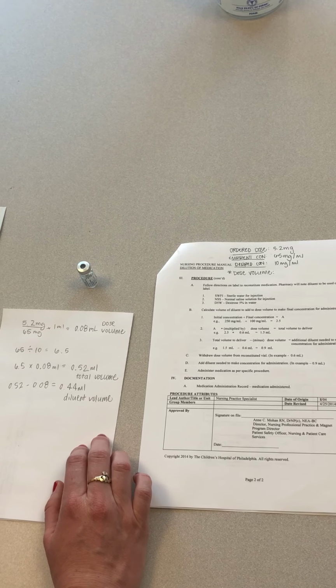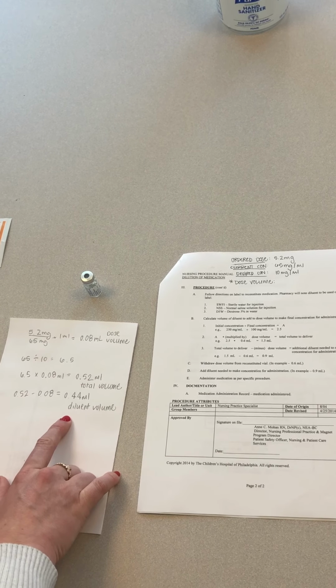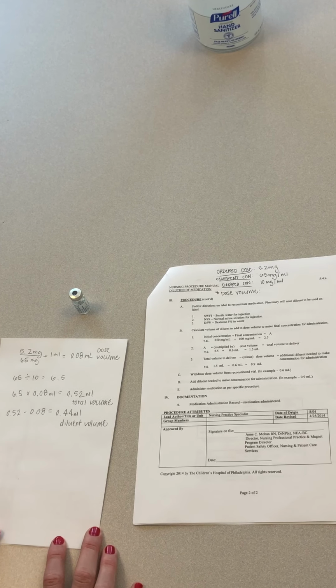So I need to draw up 0.08 mLs from the Phenobarb vial and draw up 0.44 mLs from our normal saline vial. When I add those two together, it'll be our total volume of 0.52 mLs.